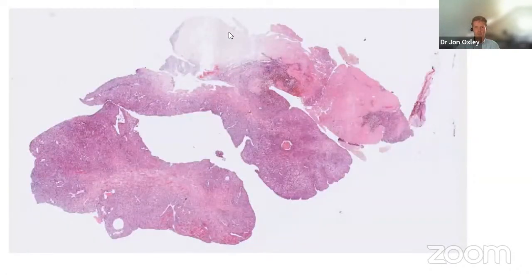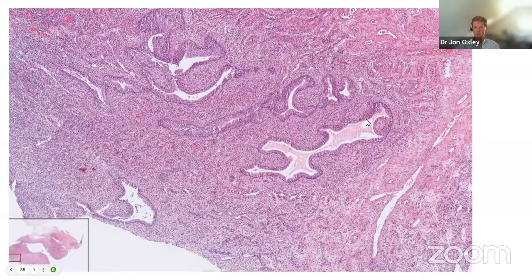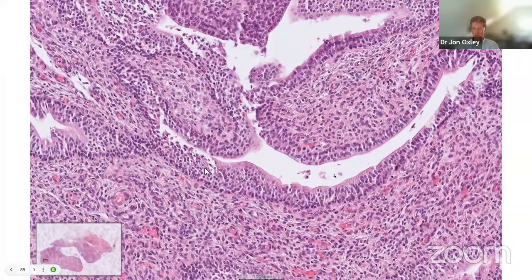Unfortunately, there was a bit of chatter across the top of the slide, which didn't help. So the scanning wasn't particularly good, and also the quality of the slide wasn't fantastic. But this is what we had, a sort of polypoid appearance with an epithelial component. And within this, we had these sort of cystic areas lined by, well, for all intents and purposes, looks a bit urothelial.